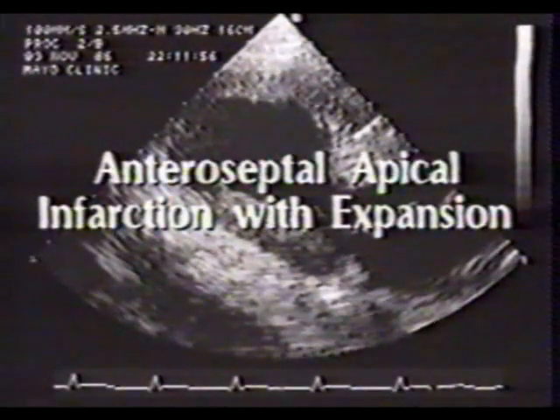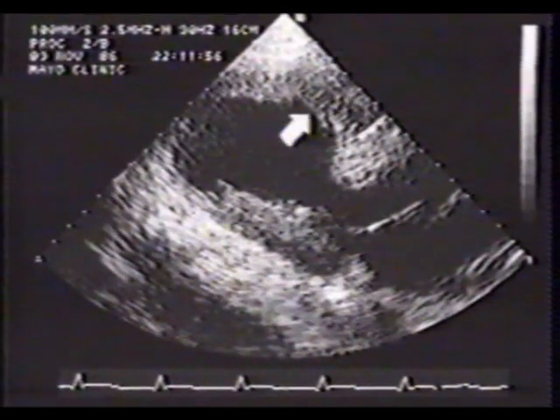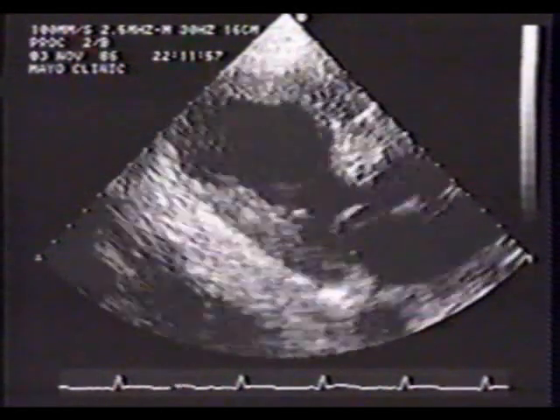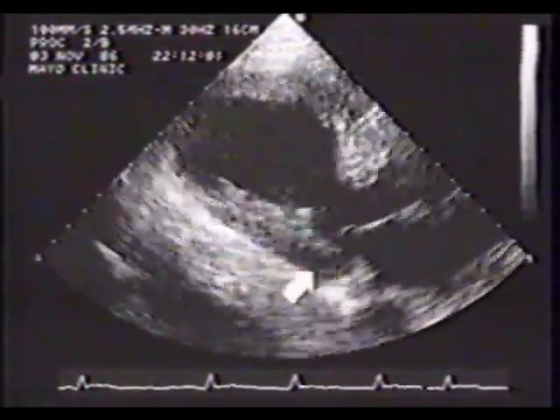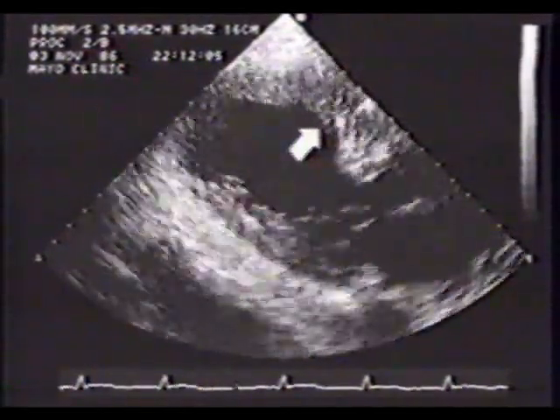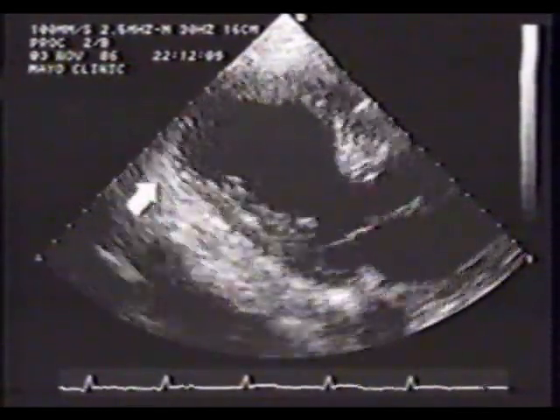This patient was admitted with an anteroseptal apical infarction. Although the septum has not yet completely thinned out, it bulges toward the RV. This represents infarct expansion. In real time, note that the basal septum and inferior wall at base and mid-levels contract normally. The infarcted segments, including the inferoapical, are dyskinetic.